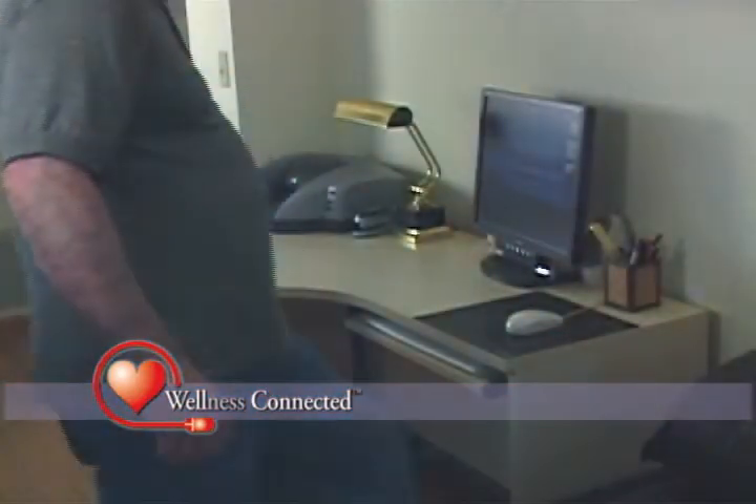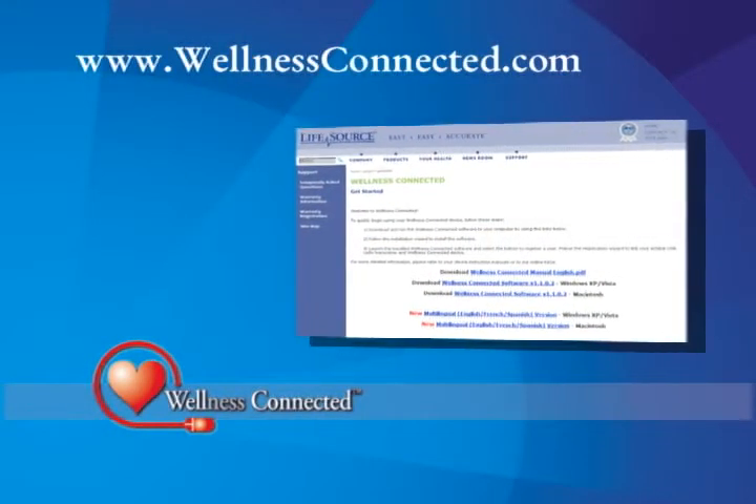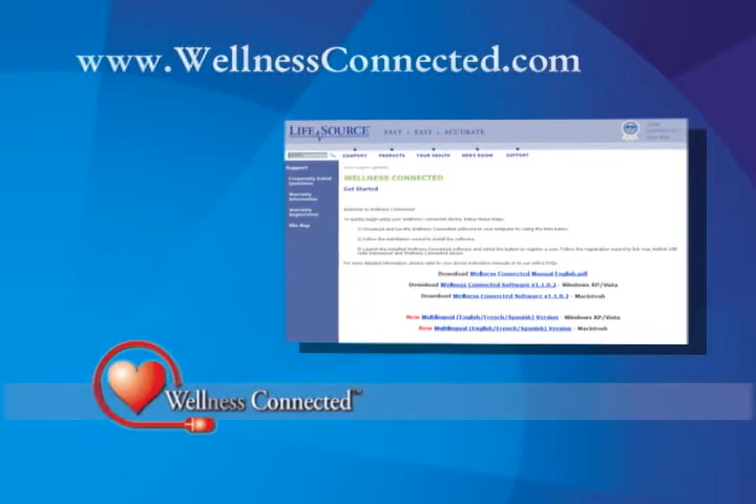Setting up the system is a very simple two-step process. First, visit wellnessconnected.com to download and follow the on-screen instructions to install the Wellness Connected software.